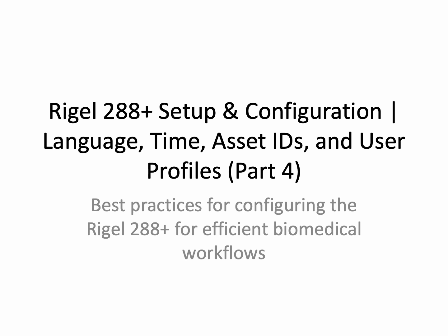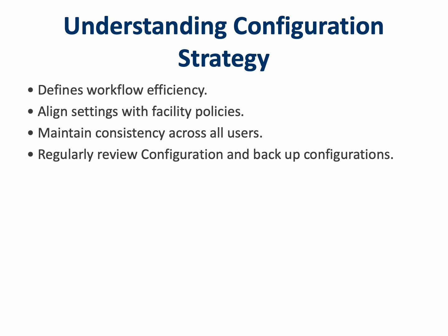So by the end of this session, you'll understand not just how to set up the Rigel 288 Plus, but how to structure it for long-term efficiency and reliability. Configuration is the foundation for reliable results. So before setting up the Rigel 288 Plus, think strategically. Each setting affects data quality and workflow.